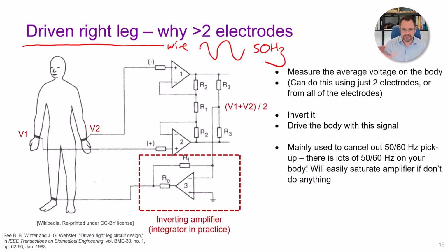I'm going to get a little bit colloquial here, but it is fundamentally correct. What we have here then is a conductor, which is the wiring in the room. We've got a conductor, which is your body. There's lots of electrically conductive bits in there. And in between them, we've got an insulator, the air gap.